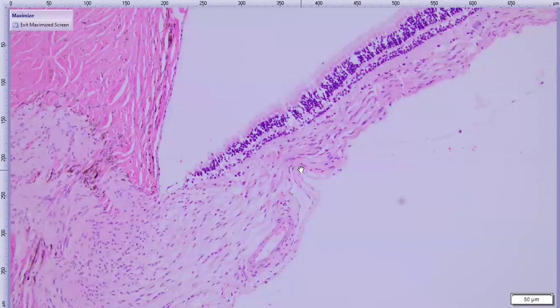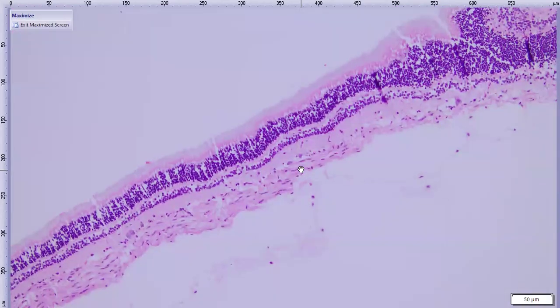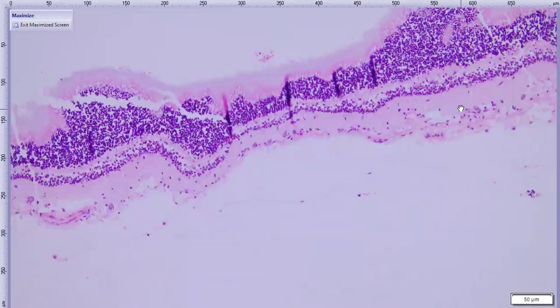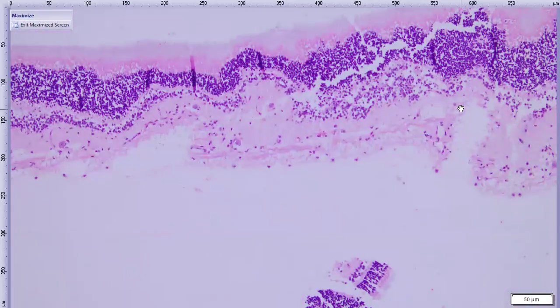So I think clinically the picture ultimately suggested glaucoma. But it's equivocal histologically, I would say. There are still ganglion cells. You could maybe decide that they're somewhat decreased in number, but again, it's pretty equivocal. So much harder to call glaucoma in this goat. But given the buphthalmia and the clinical signs, it's suspicious for it at a bare minimum.